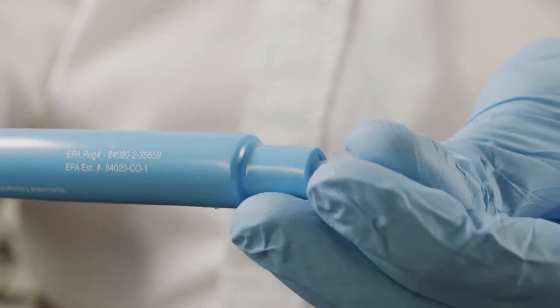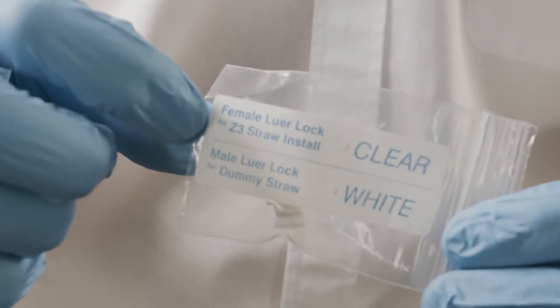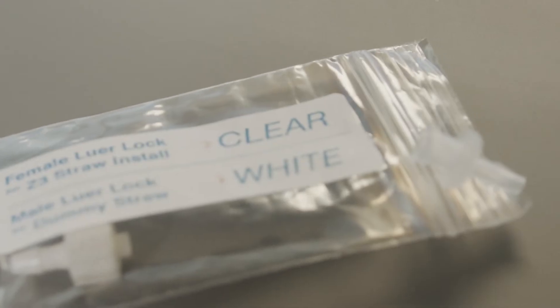Then twist the female lure lock into the male end of the straw. Check the lure lock bag label to help identify which one is the female lure lock.